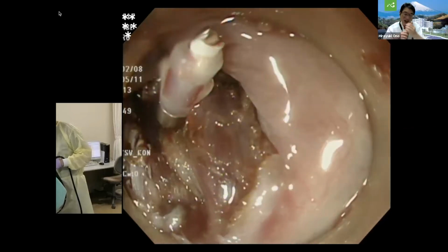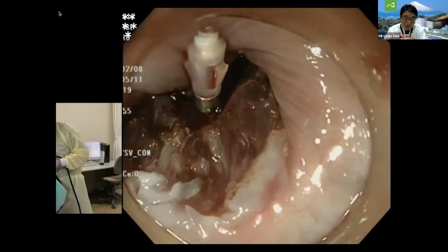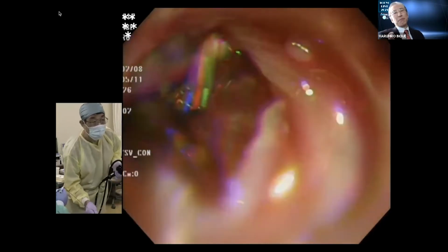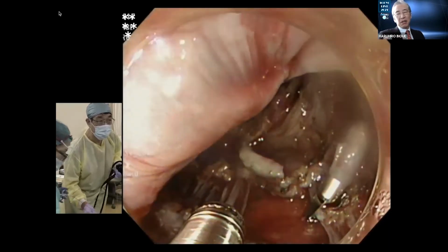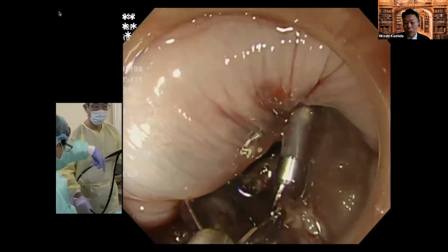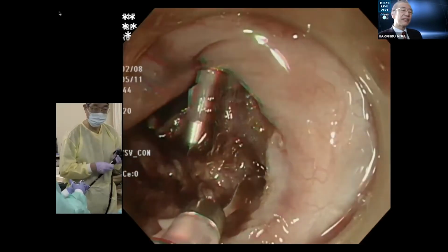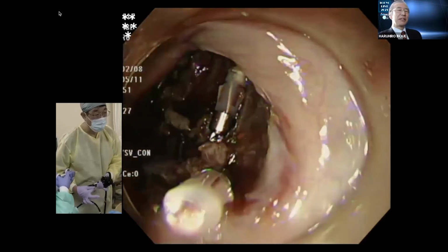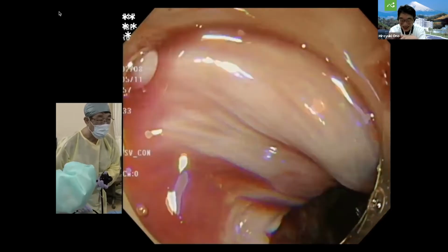So I have to be cool, be calm. The disposable one-way clip is sometimes difficult, because we cannot repeat the procedure. I agree. The open and close clip is also one way. But Ono Sensei's technique is so good. It succeeded. I succeeded.